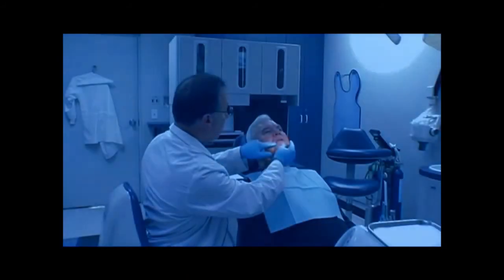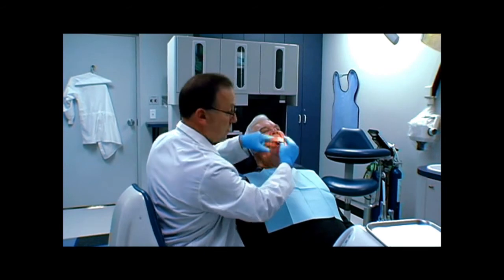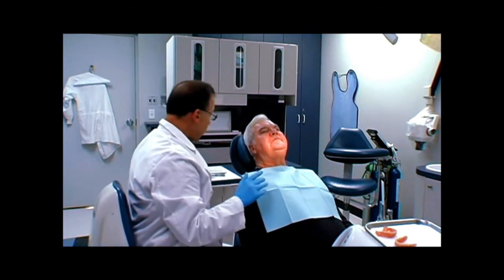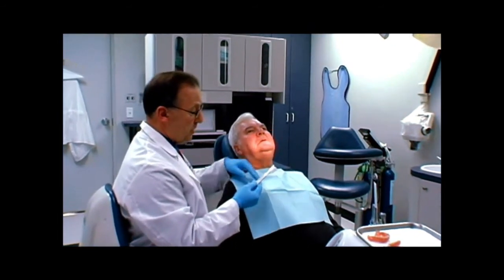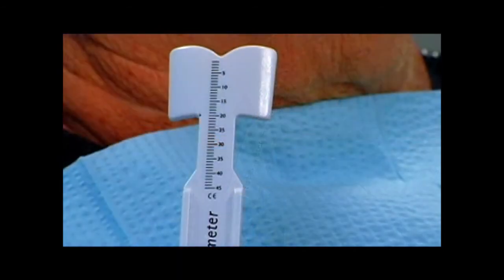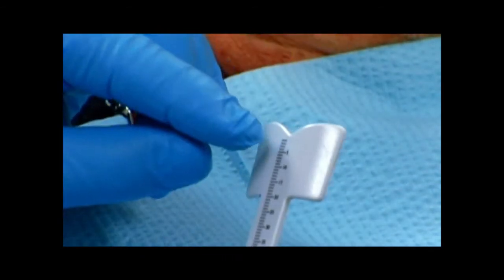First thing I want to do is open up, Mike, please. And we're going to take the patient's denture out. And I'm going to take the papillometer. It's a device that's going to help us give the lip line communication to the laboratory. It has a little device in the back that's going to rest against the anterior papilla.